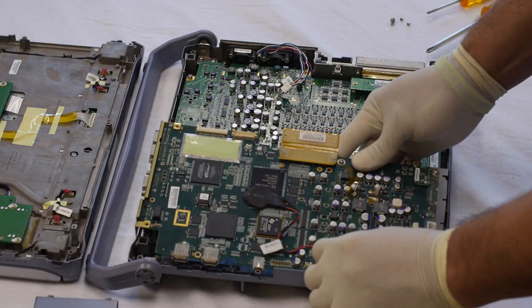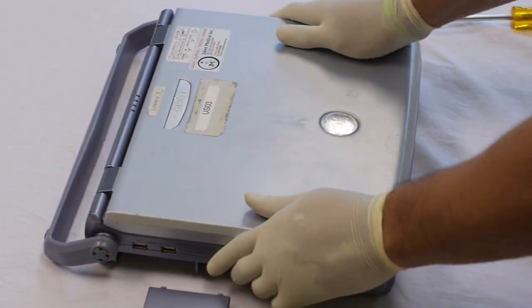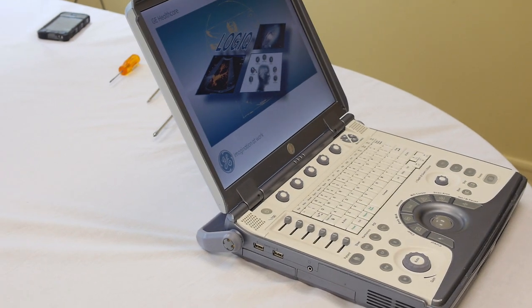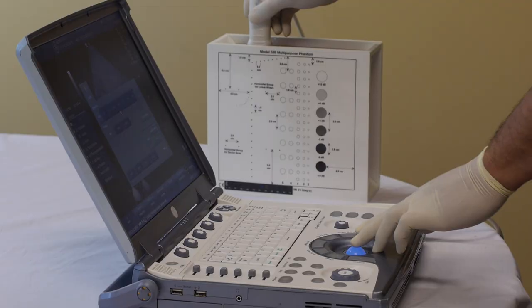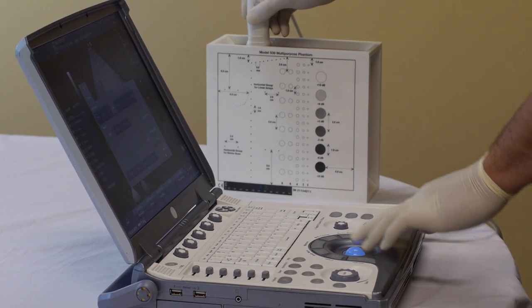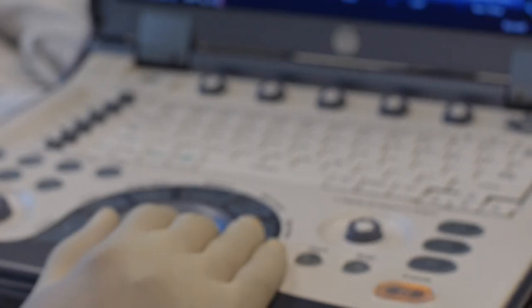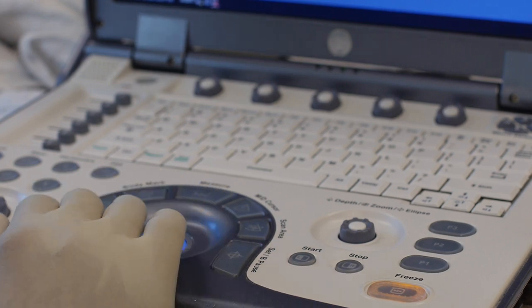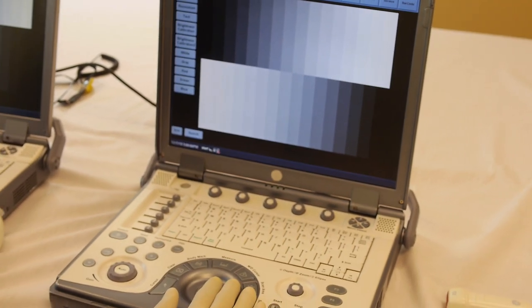After everything checks out, we reassemble the system and proceed to test the power supply, battery charging board, and ensure that the screen color is standard. Once the system is restored, we test several probes and save test data to the system. In the final stages of repair, we inspect the system's housing and assure that all serial ports are functional. After the system has been thoroughly tested and repaired, the product is ready to be sent to the customer.